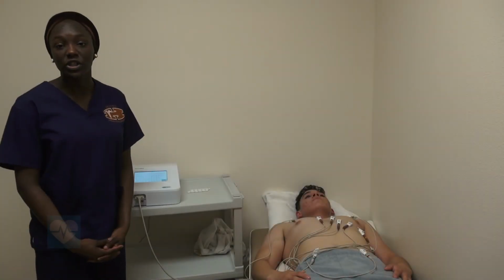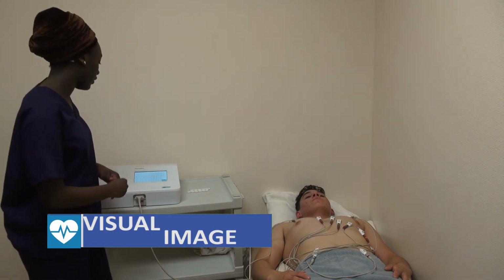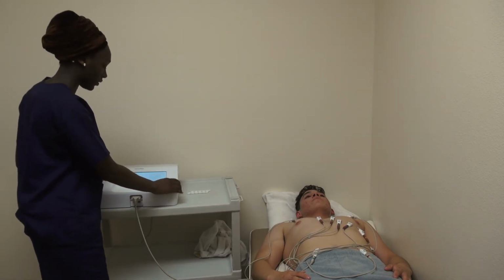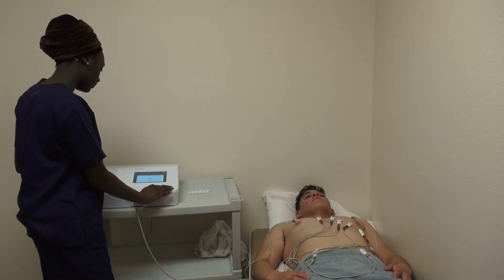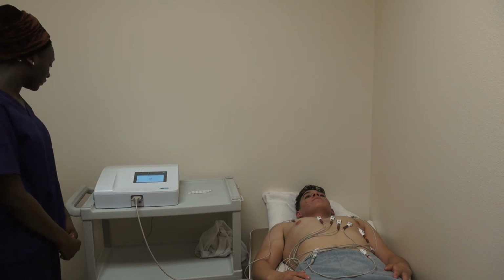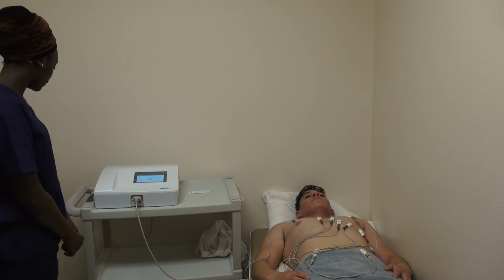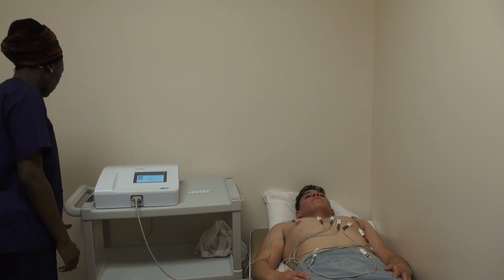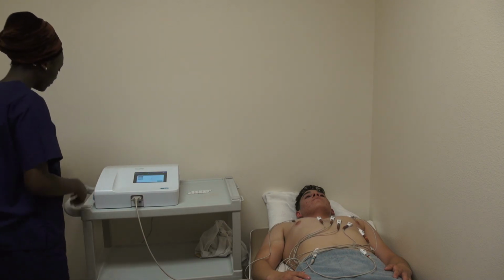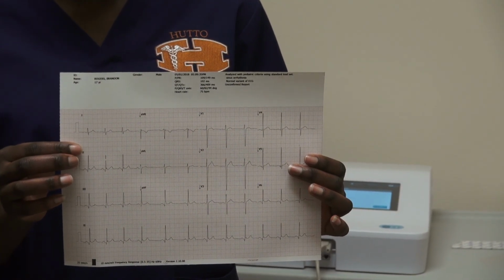Once the EKG machine has analyzed the rhythm of the heart, you can then print out the visual image of it. And now here is your visual representation of an EKG.